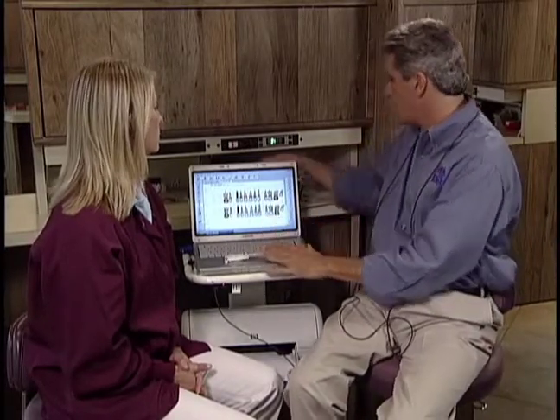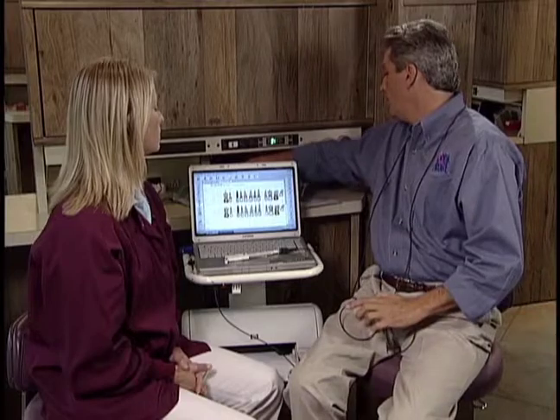Now I'm not using the Florida probe handpiece to measure furcation. I can lay it down on my tray. Some people put it on the patient's bib. I'm using my Nabers probe, and I'm doing exactly the same exam that you've always done for furcation, just you are using the foot pedal to record, maintain asepsis, a class 1, 2, or 3 of furcation.